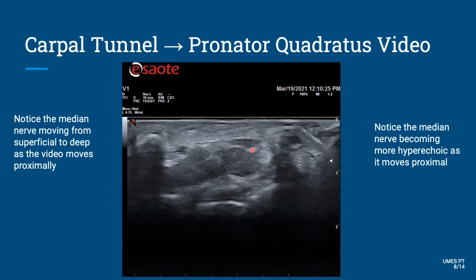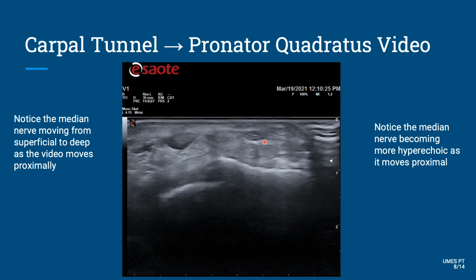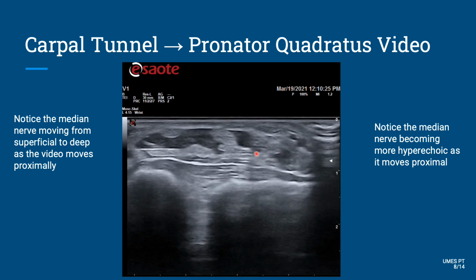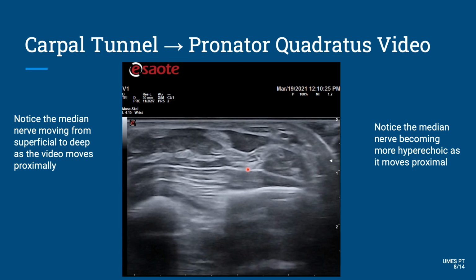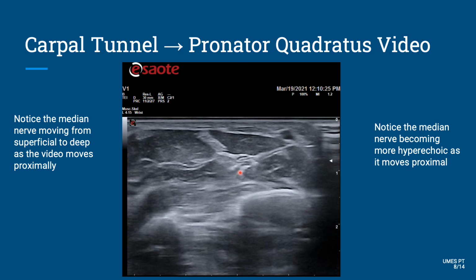So again, here's the median nerve, and I'll follow along with you. So here, moving, moving, there it is, and there it is at the pronator quadratus.